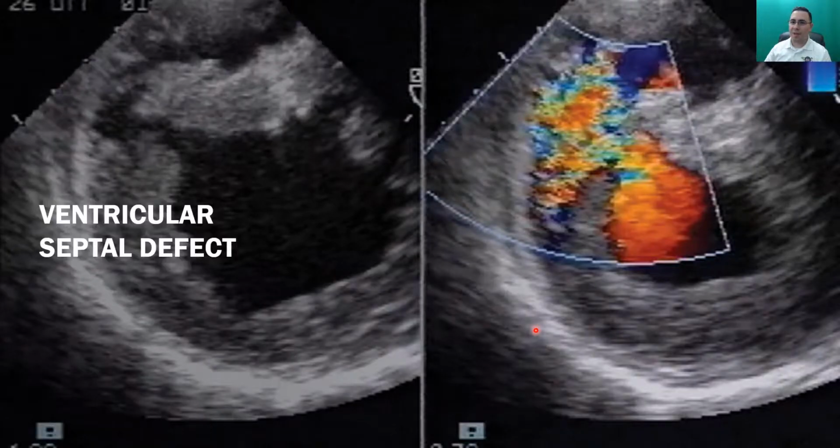So here I have a picture for a ventricular septal defect in the muscular area. Remember something, the congenital ventricular septal defects are more common in the membranous part of the interventricular septum. But here this is in the muscle area, all right? And if we use the color flow, we can see the color going from the left ventricle to the right one, okay?